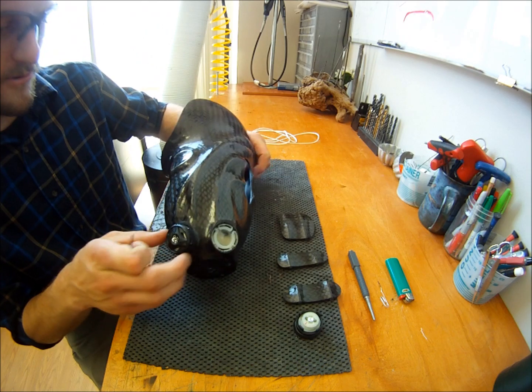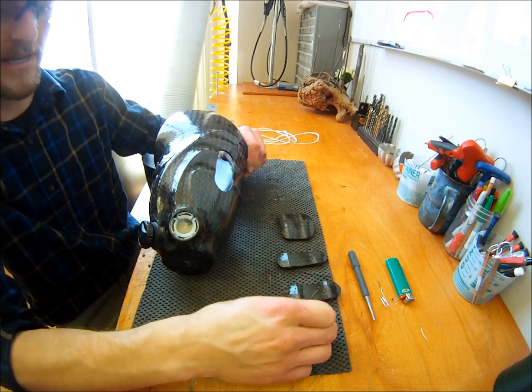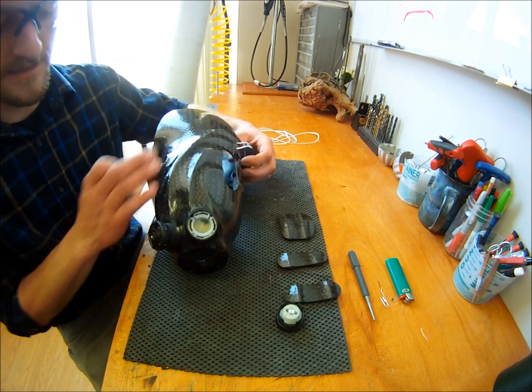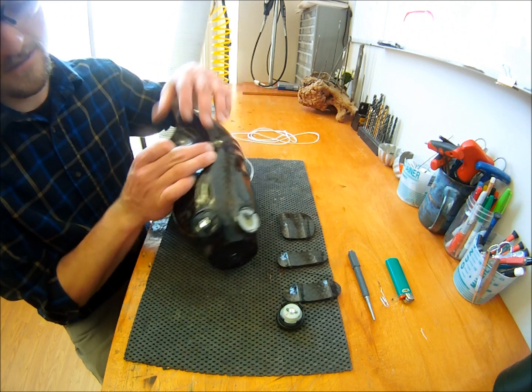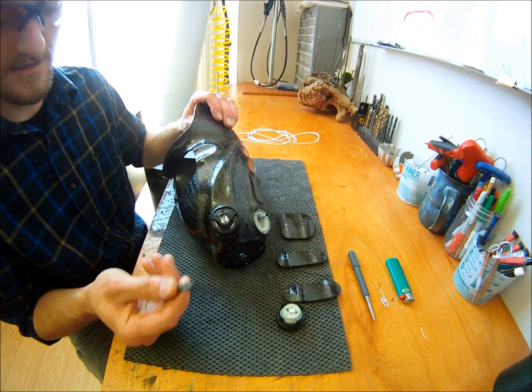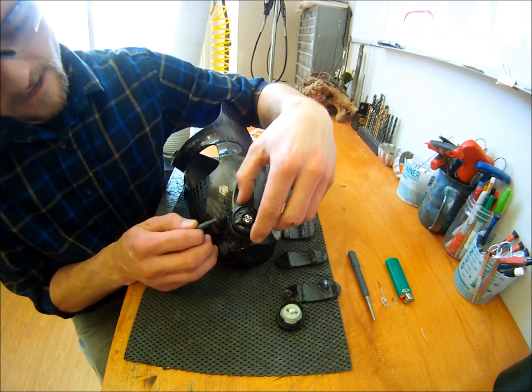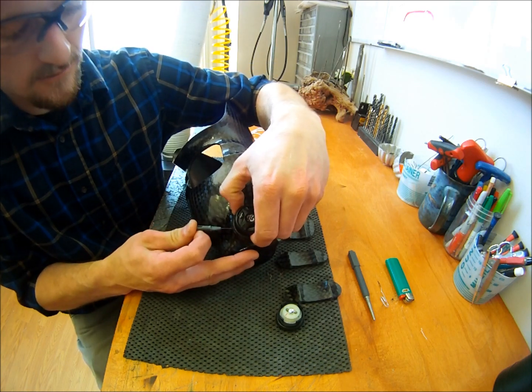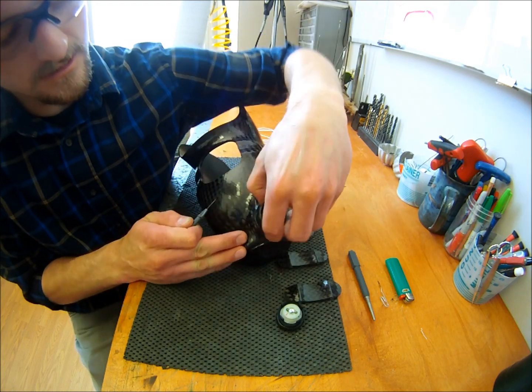Okay, we're going to go over removing the dial, lacing the socket up, and tying the knot into the spool. You want to start by releasing tension and pulling the slack out of the dial. To release, insert your T6 tool into the pilot hole on the side. Grab the base of the dial, and while pushing inward, give the dial a twist clockwise.